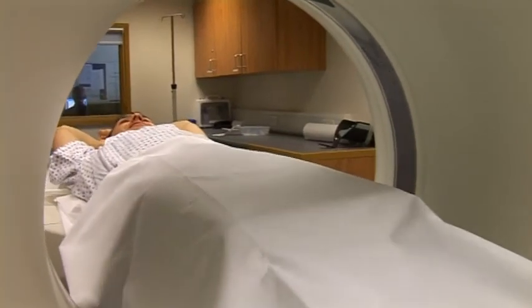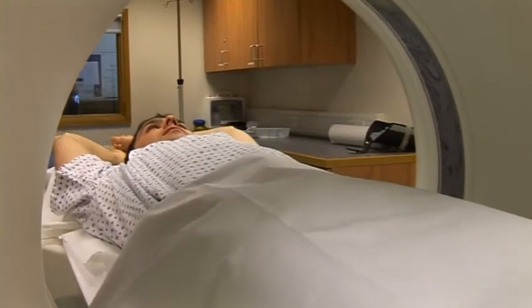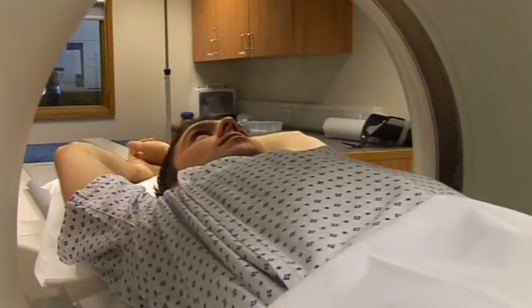A CT scan is a complicated x-ray where the x-ray machine spins around a gantry all the way around the clock face, takes a picture at every point on the clock face, and combines them to form a cross-sectional image.